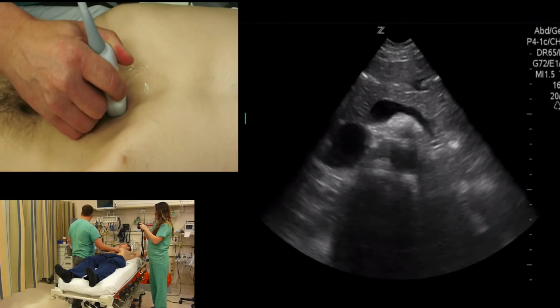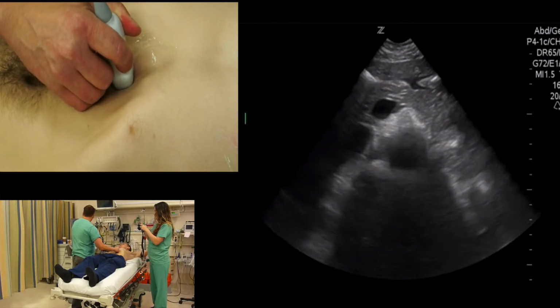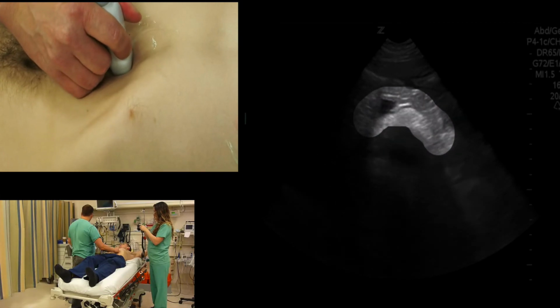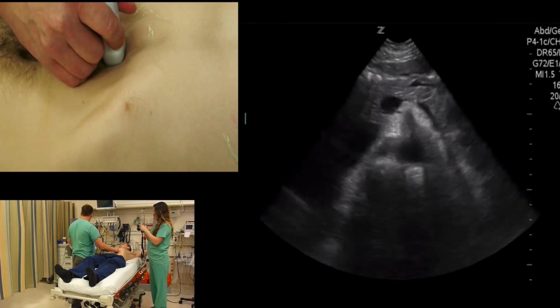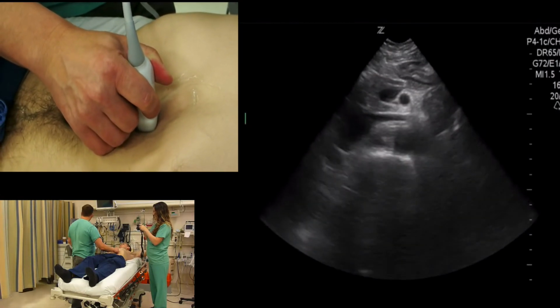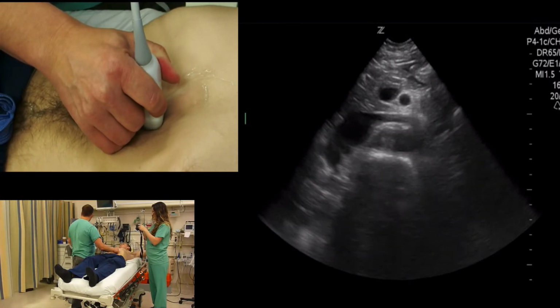As we go just inferior, we have a great picture of the portal confluence and the splenic vein that sits right on top of the superior mesenteric artery. This is our Mickey Mouse sign. We had a nice view of the hepatic artery and a little bit of the celiac, but it wasn't a great seagull sign, so we just progressed down to the level of the SMA.